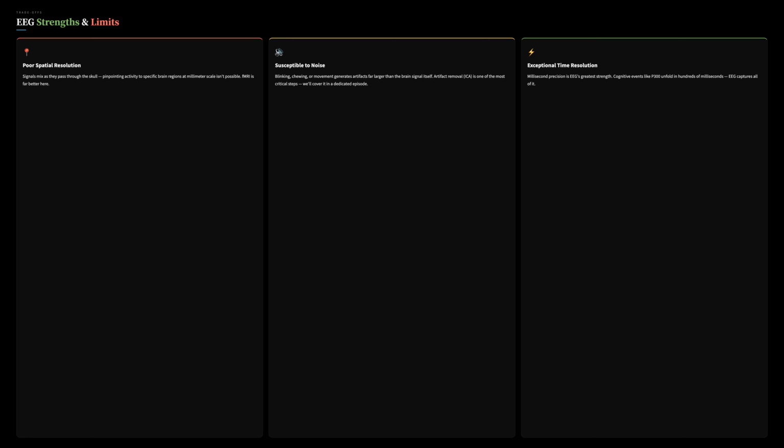Artifact removal using ICA is one of the most critical steps in EEG analysis, and we'll dedicate a full episode to it. But EEG's greatest strength is unmatched time resolution. Cognitive events like P300 unfold in hundreds of milliseconds. EEG catches all of it.